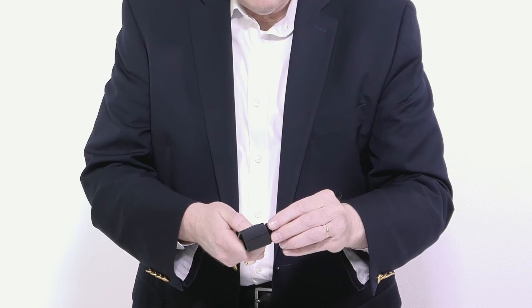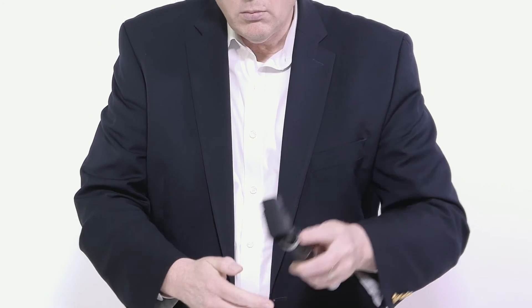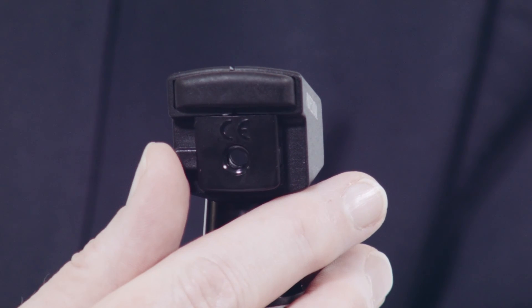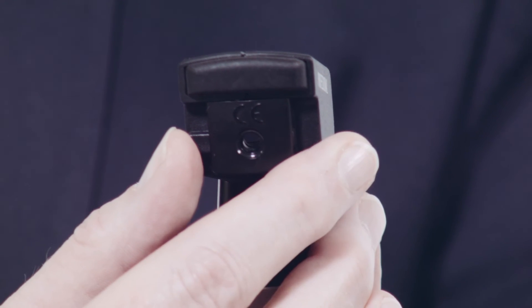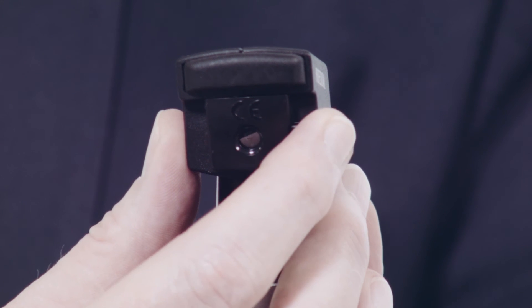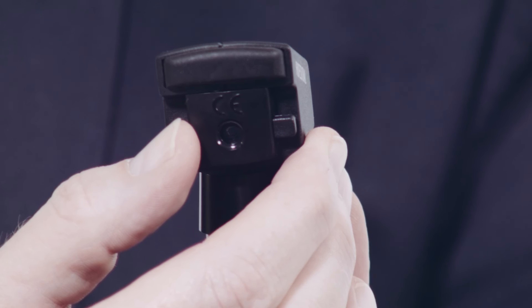To interchange the brow rest, disconnect the default rest and attach the included brow extension. There are two aperture control positions: 2mm and 4mm. Slide the control from left to right to change from large to small aperture. The smaller aperture reduces glare from trial lenses.